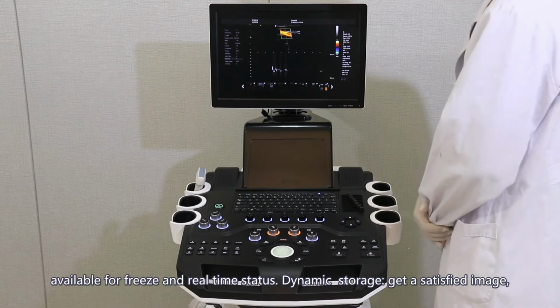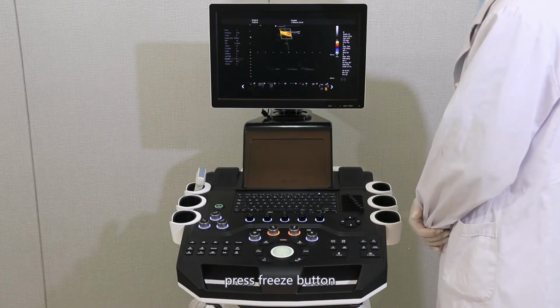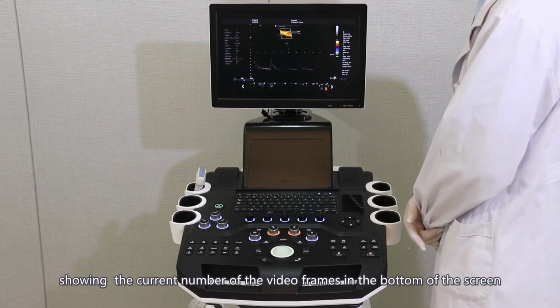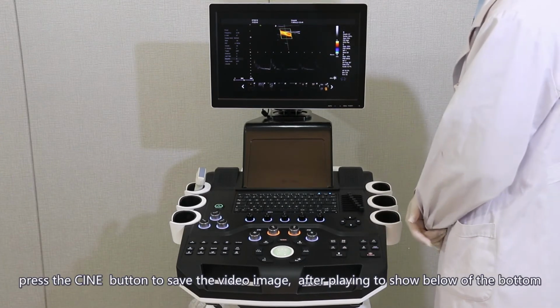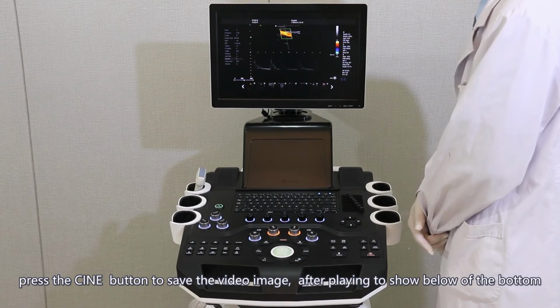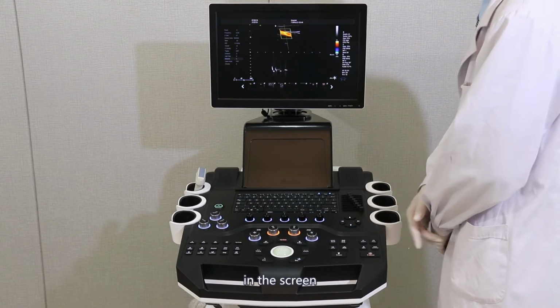Dynamic storage. Get a satisfied image. Press the Freeze button. It shows the current number of the video frames in the bottom of the screen. Press the Cine button to save the video image. After playing, it is shown below the bottom of the screen.